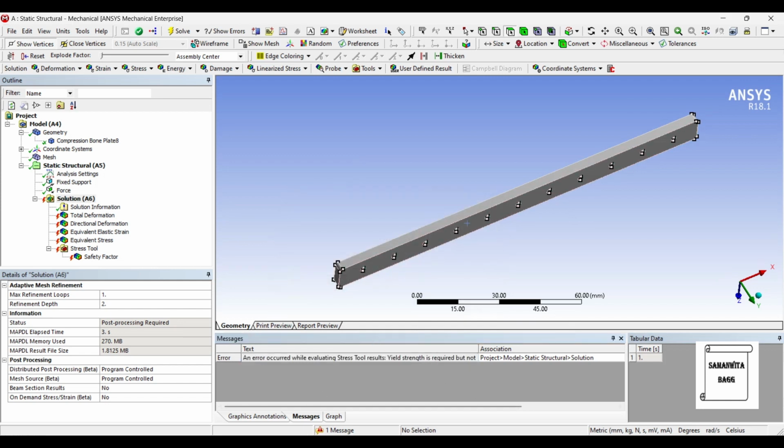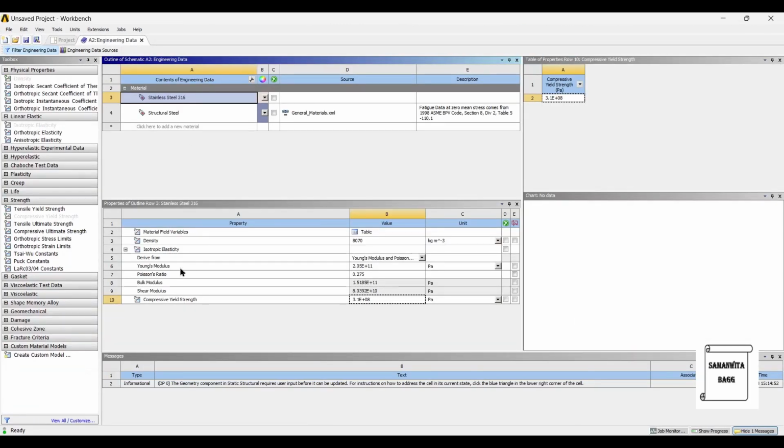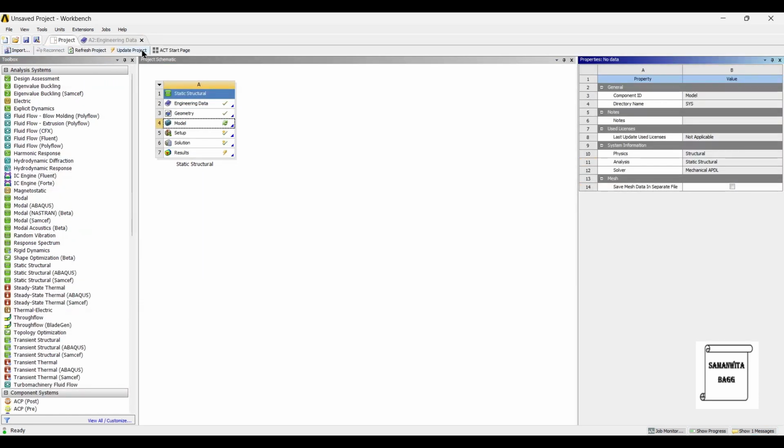Okay, so it is asking for the yield strength. For that, I'll go to engineering data, and I haven't given the tensile yield strength. The value of tensile yield strength is 620 megapascal. I'll go to project and update project.